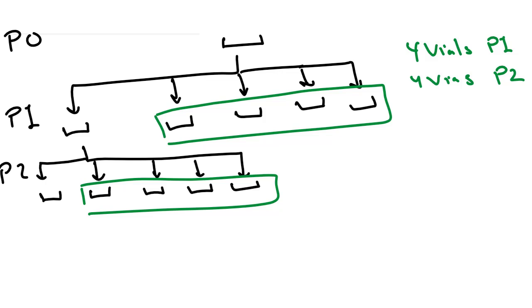It depends on the cell type, but I could go from 100% confluent cells and go to a 1 to 10 and actually freeze down 8 and then do another 1 to 10 with 2 other plates and keep going like that and have many more vials of cells. But essentially what will happen is that I will have 4 vials then, if I keep doing this, right, of passage 3, 4 vials at passage 4, and while I'm doing this, I'm trying to figure out for whatever system I'm studying that I'm using these cells for, at what passage number does that system sort of go awry and I can't go past that passage number.